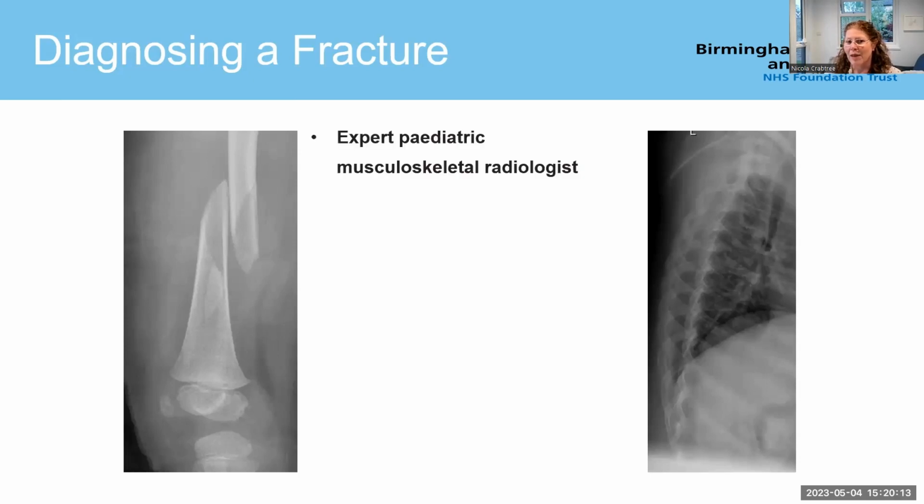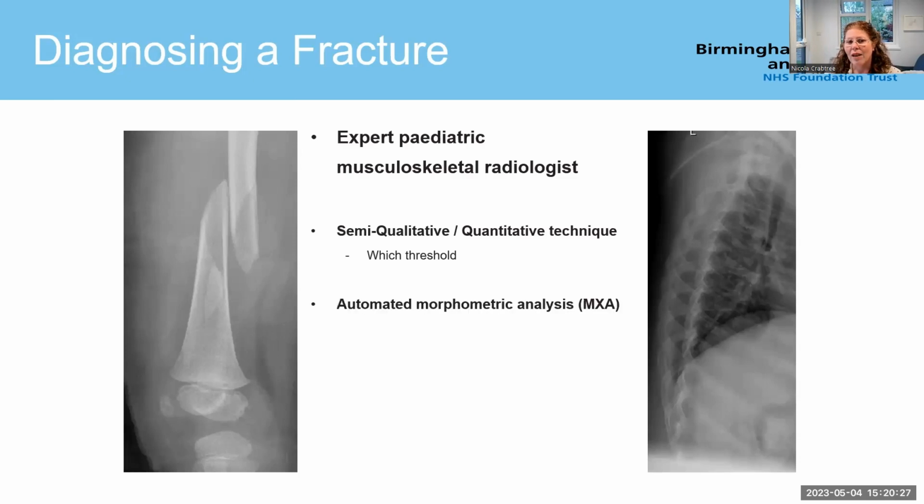We use an expert pediatric musculoskeletal radiologist. There are several techniques we can use. We can use a qualitative technique, a quantitative technique, a semi-quantitative technique. We can use automated techniques.